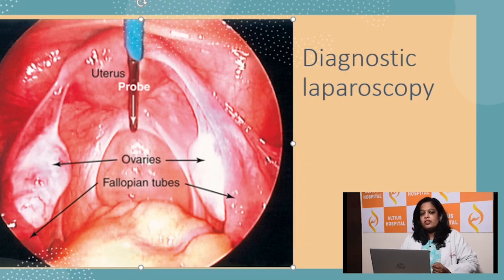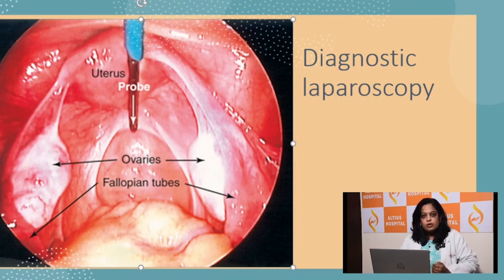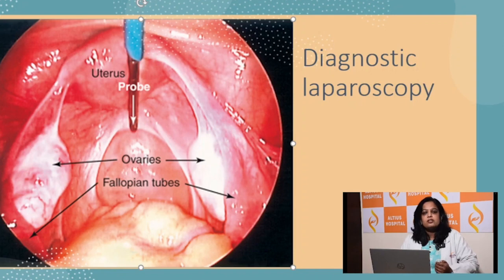We also look for any adhesions on the posterior surface of the uterus to the rectum, which can be relieved if she is having problems with constipation or dyspareunia, which can indirectly be a reason for endometriosis.